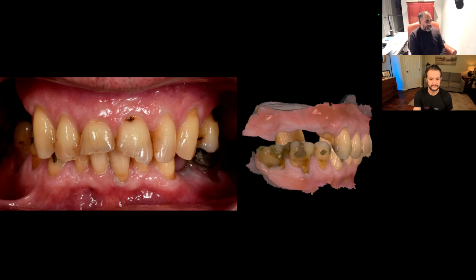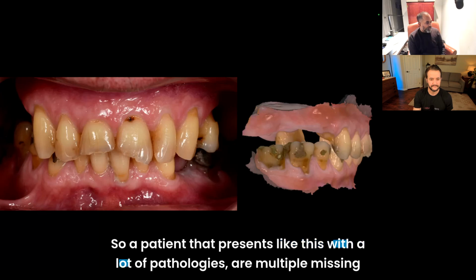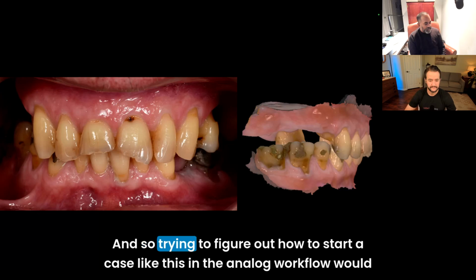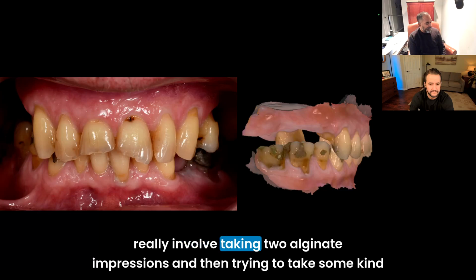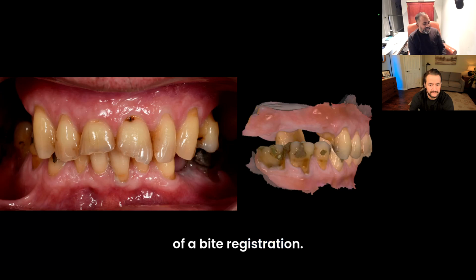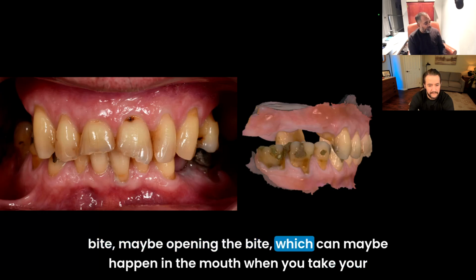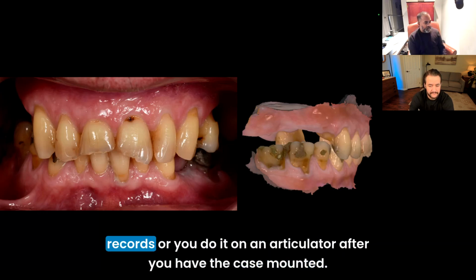So a patient that presents like this with a lot of pathologies, there are multiple missing teeth, there's a collapsed vertical dimension, there's severe wear, and so trying to figure out how to start a case like this, in the analog workflow would really involve taking 2 alginate impressions, and then trying to take some kind of a bite registration. Maybe even needed to make a wax rim and have the patient back to be able to get a proper bite. Maybe opening the bite, which can maybe happen in the mouth when you take your records, or you do it on an articulator after you have the case mounted.